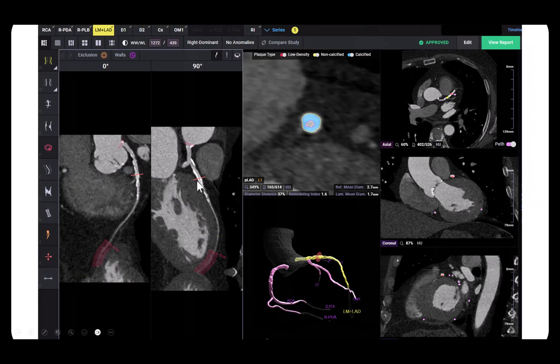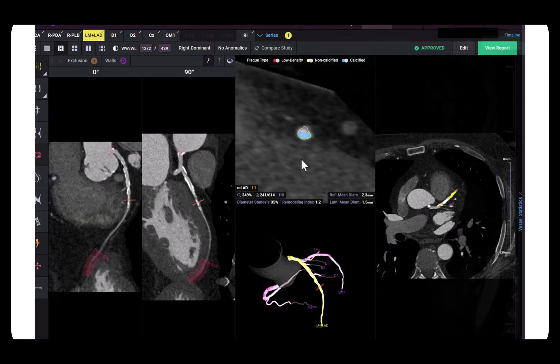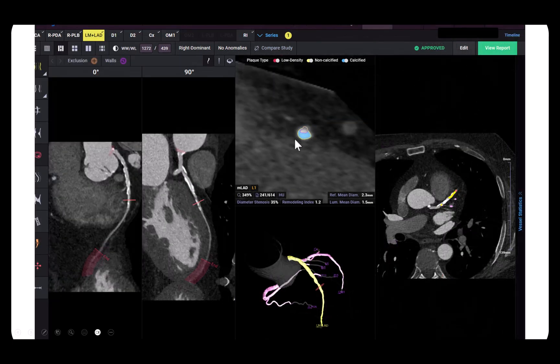This is the coronary CT, showing circumferential calcification. This is just proximal to the proximal cap. There is also significant calcification within the occlusion and distal to the occlusion.